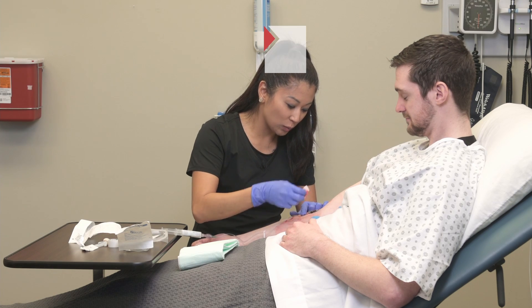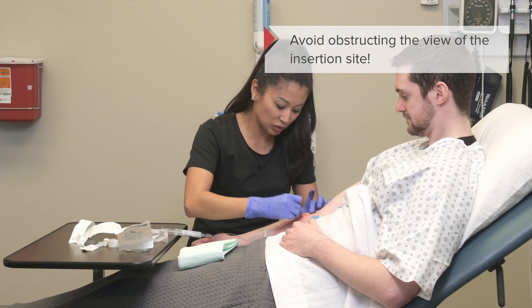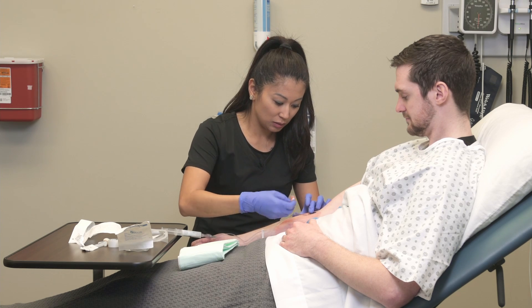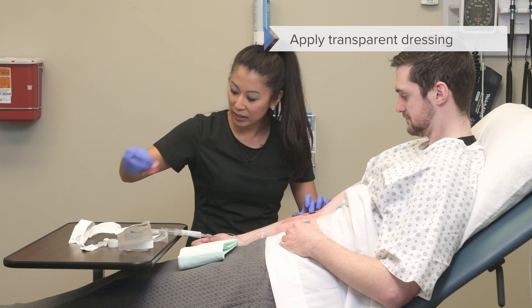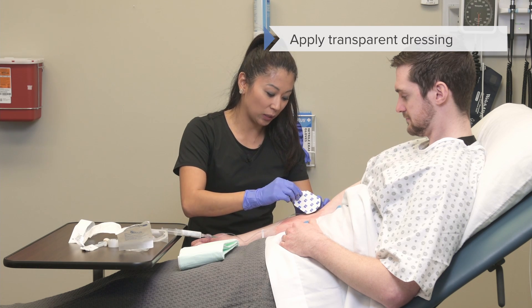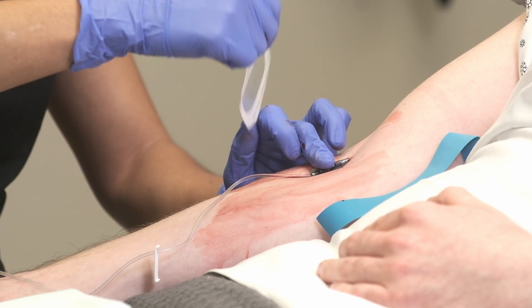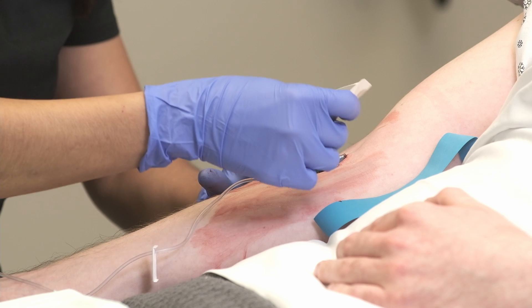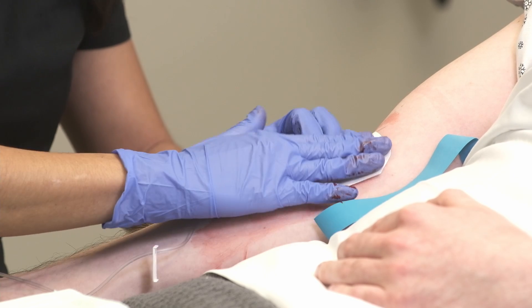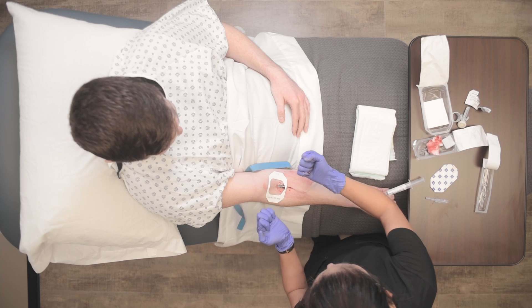When we're doing this, avoid as much as possible touching that insertion site. The main thing is that we have this stabilized, and now we can put on our transparent dressing. The reason I'm doing this is I want to cover the site as quickly as possible and hold that catheter steady so it doesn't budge out of the vein.